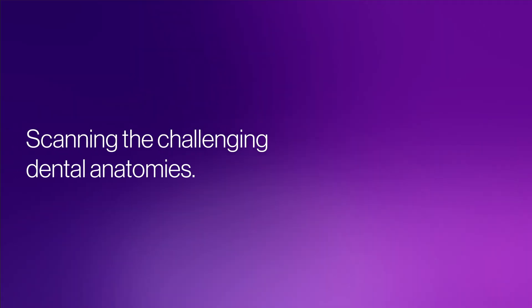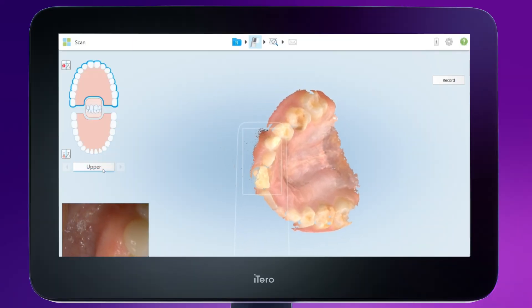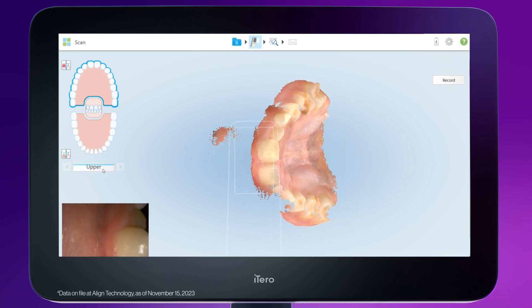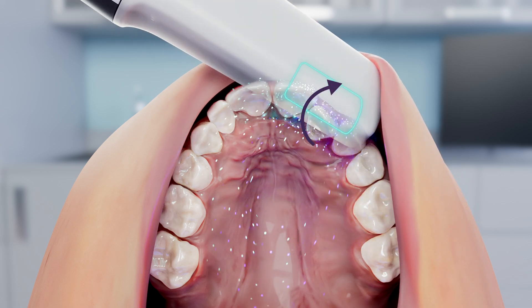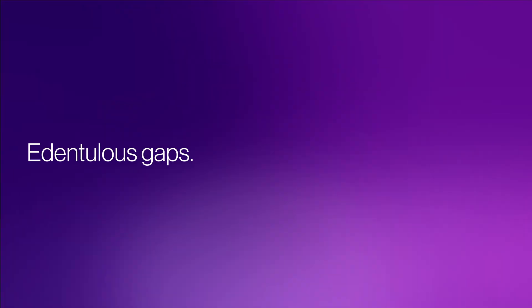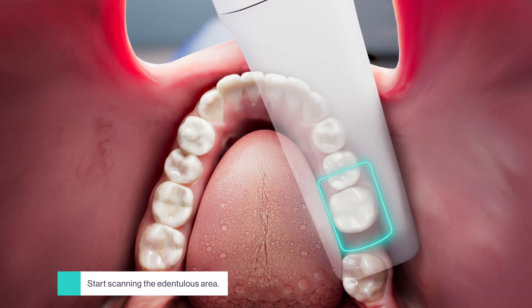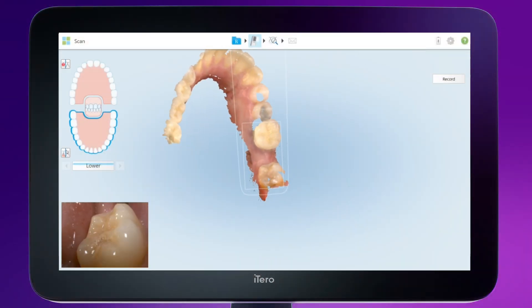Here are some guidelines for scanning specific dental conditions. The iTero Lumina scanner has multi-angle capture to enable faster and easier scanning for crowded teeth. To ensure a successful capture, use tilting motions and continuously move the wand to fill in all the anatomy. Leverage the iTero Lumina scanner's large capture distance to capture anatomy that includes missing teeth. Hover above the edentulous area, parallel to the occlusal plane. Tilt the wand buccally and lingually to complete the entire ridge.